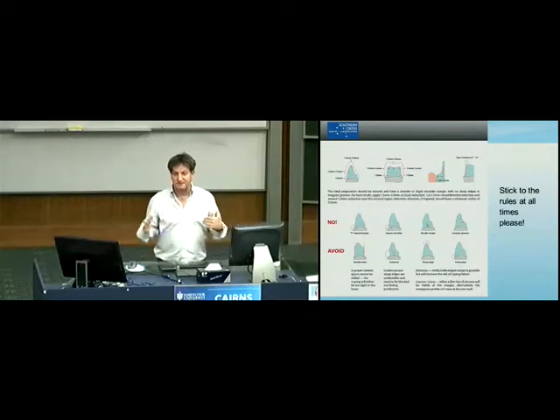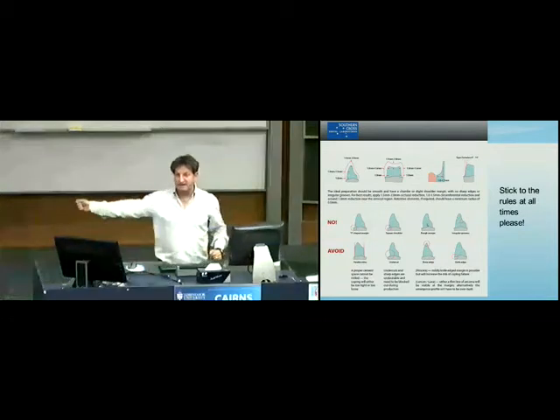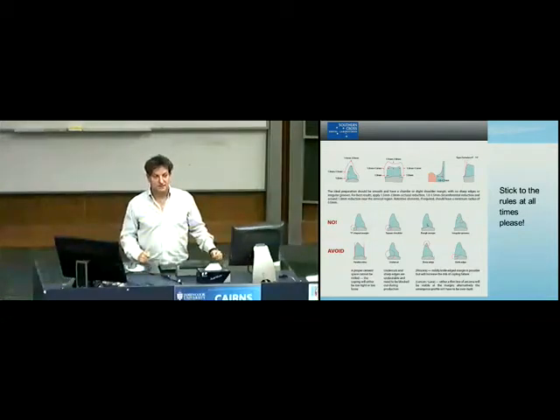Okay, we've got enough thickness of material. So I really want you to be cognizant of the following things. Wide margins, number one. See the bicycle track all the way around. And look at it, please. I mean, don't take the impression out of it and hand it to your nurse and say, send it to the lab. Please, wash it out.